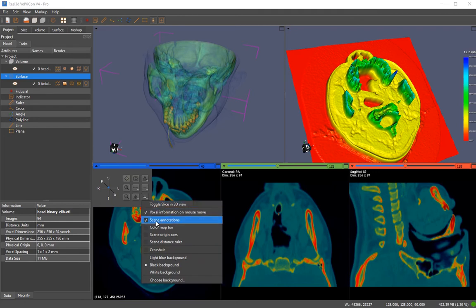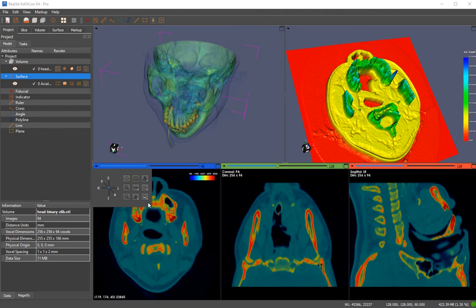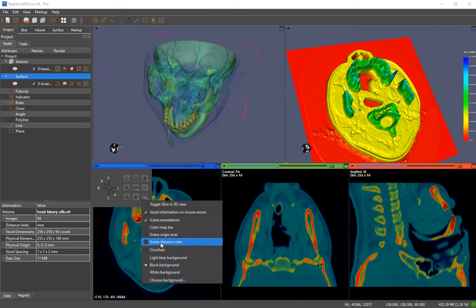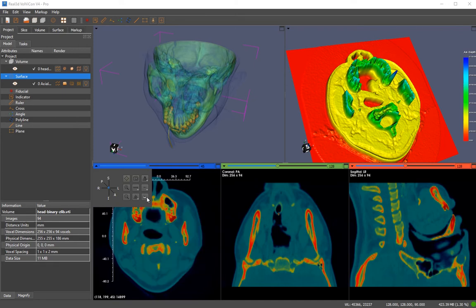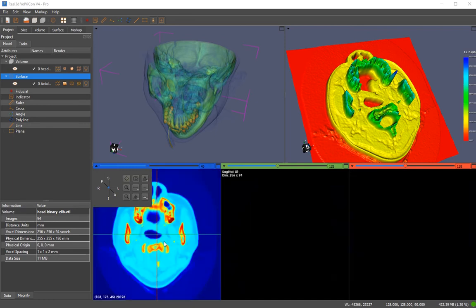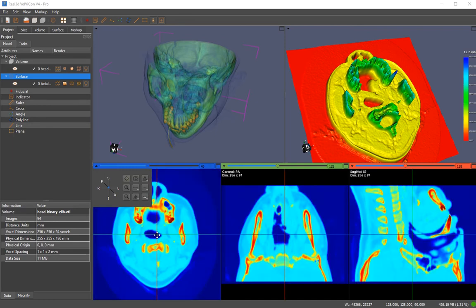You have voxel information on mouse move — on hovering you see the voxel intensity and voxel coordinates. You can enable or disable scene annotation, and enable or disable the scene annotation color map.